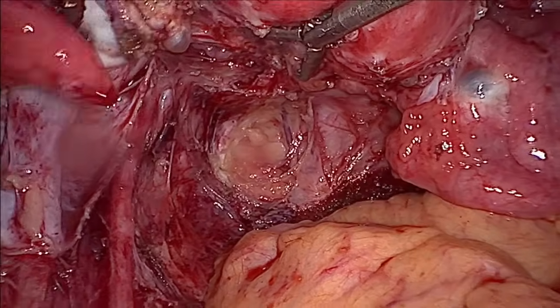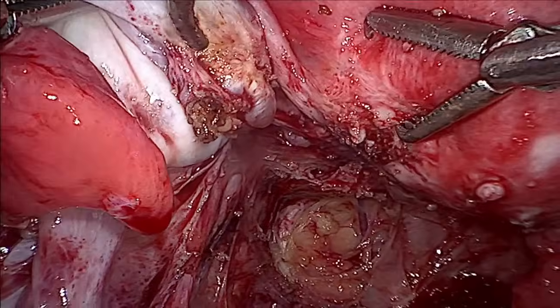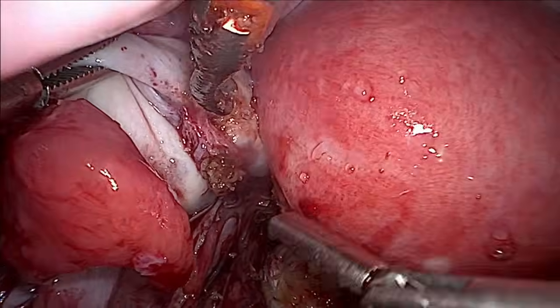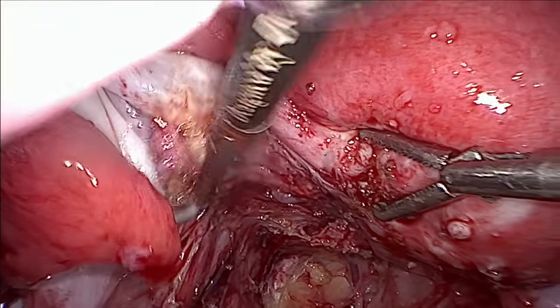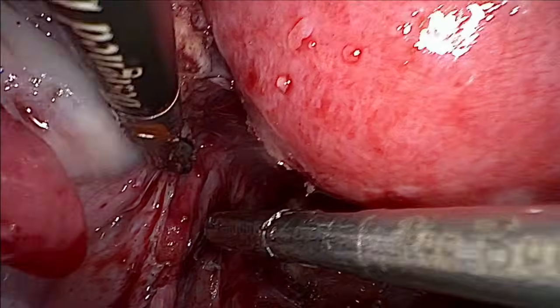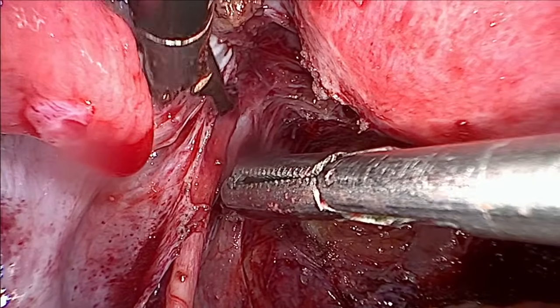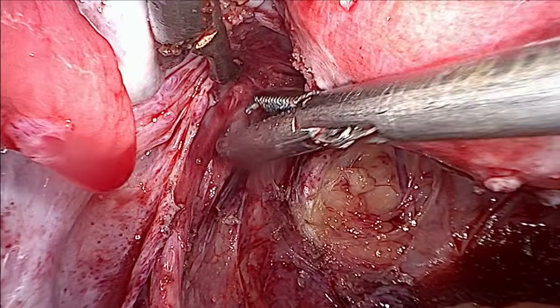Okay, I think here. Okay, this is the cyst here. Okay, which can be tackled later. Okay, once I will have a look at the ureter again. Okay, so what we can do here, okay, we can safeguard the ureter.